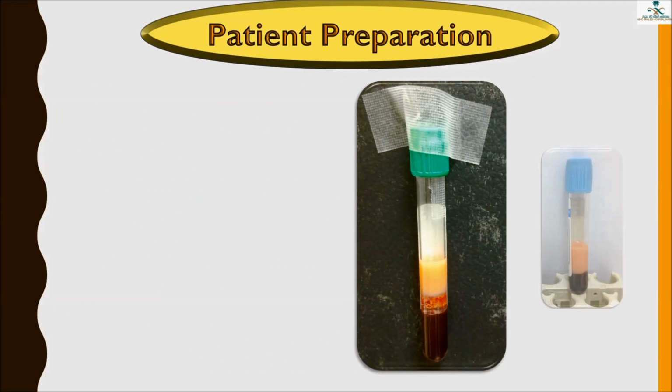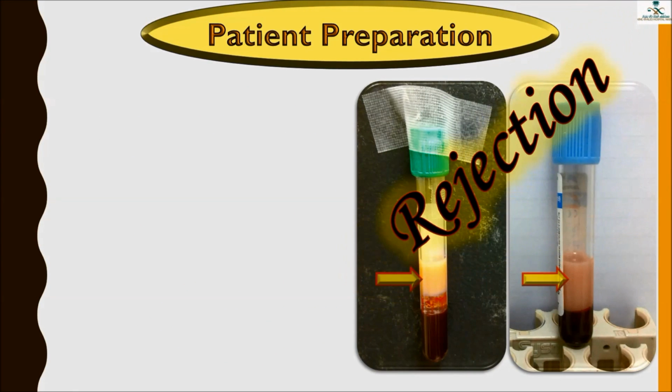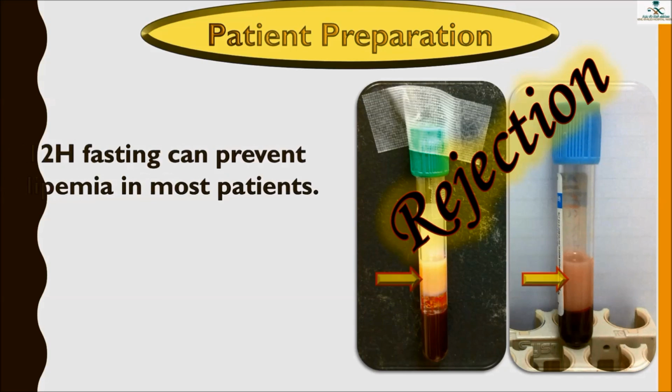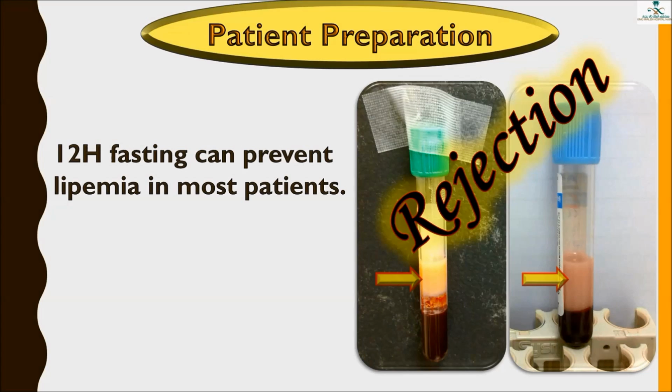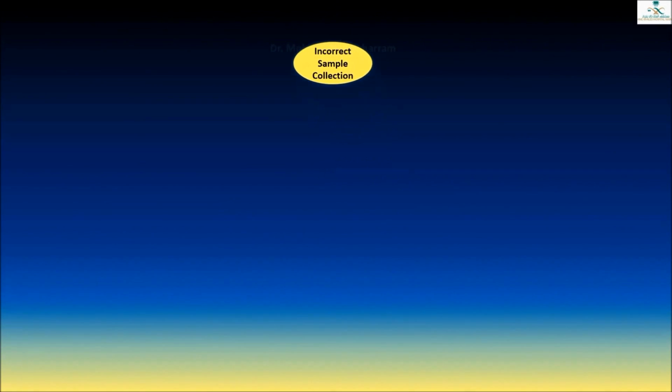Here are examples of lipemic samples. Such samples cannot be processed in our hospital. 12 hours fasting can prevent lipemia in most patients. The next pre-analytical error is incorrect sample collection.